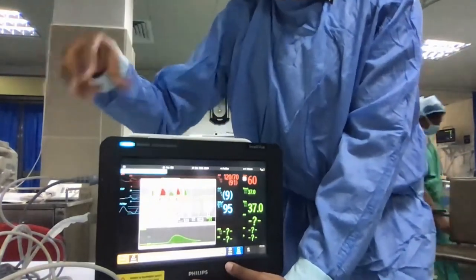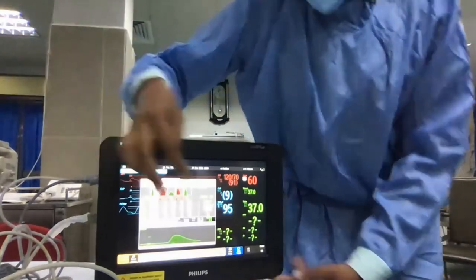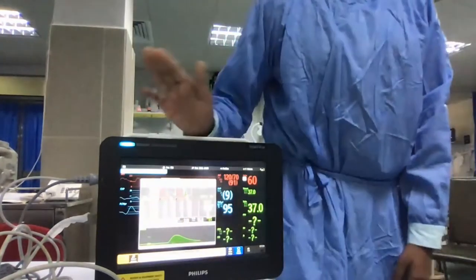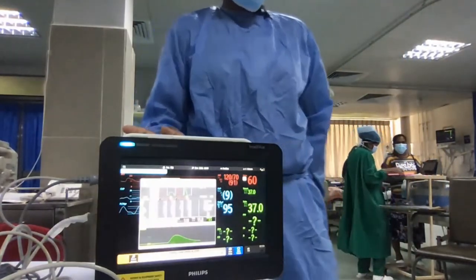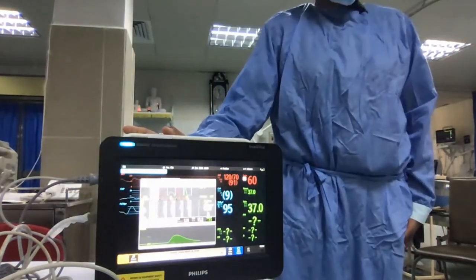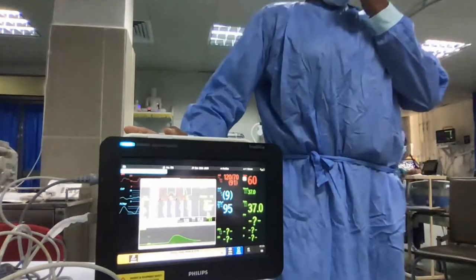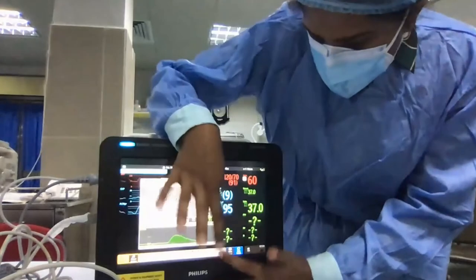So from cardiac output, we will get the thermodilution factors. From CCO, we will get all the pulse contour factors. So save cardiac output and calibrate continuous cardiac output. Did you all get it? So it analyzes the pulse wave as well as the bolus. CCO is for the pulse wave analysis and CO is for the bolus and the cardiac output analysis. Understand? Okay, this is clear. You can ask any question after this.